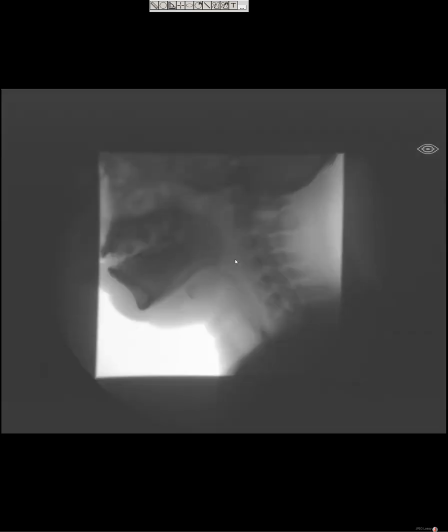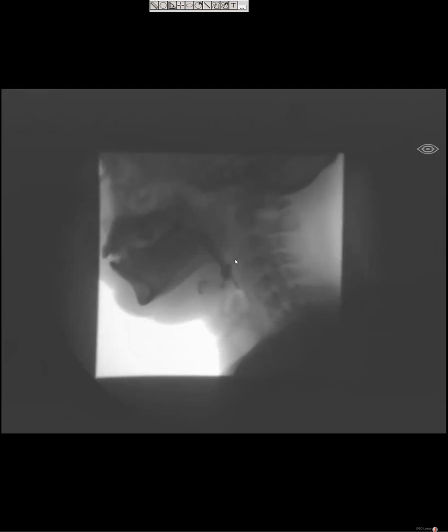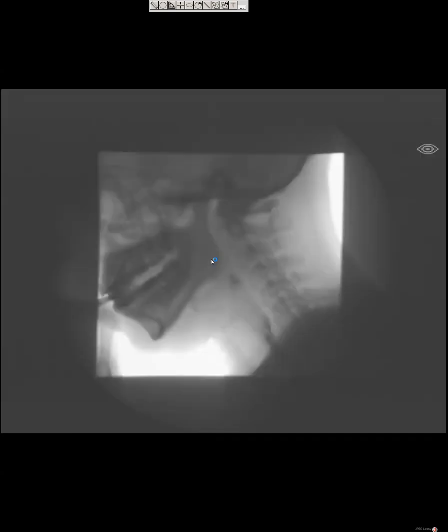It almost looks like a modified barium swallow because they're taking like a video or something. Yep. So this was with the speech pathologist, and it was a patient that had kind of a chronic globus sensation or difficulty swallowing. And on the early sets of images here, not much to see unless you're really astute, maybe. There's prevertebral soft tissue or retropharyngeal, possibly. Teresa, we can't hear you well, but did you say something about a retropharyngeal soft tissue?